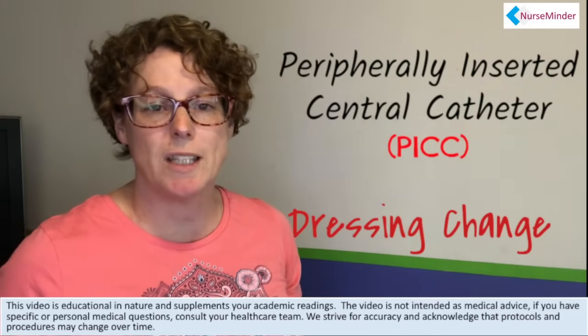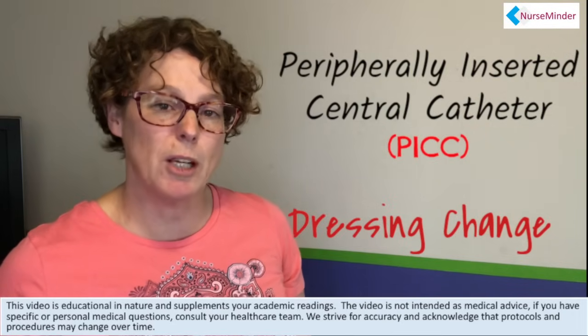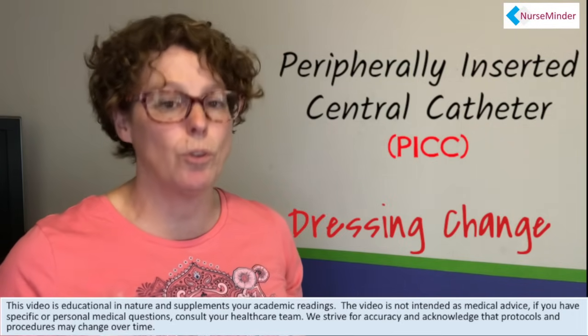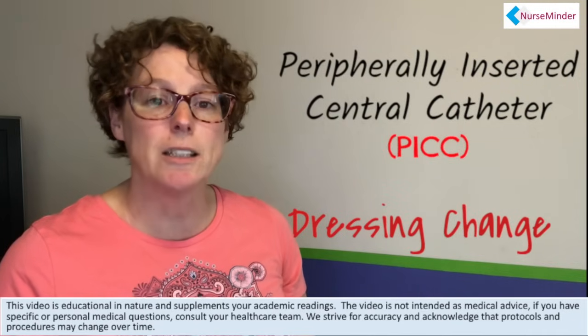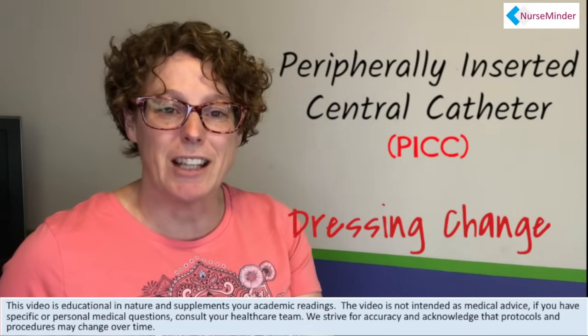Today we are doing a PICC dressing. Remember that these tutorials are simply informational and you always need to be checking with your agency's policy to make sure you're following the guidelines for your patient population. Now let's get to the lab.